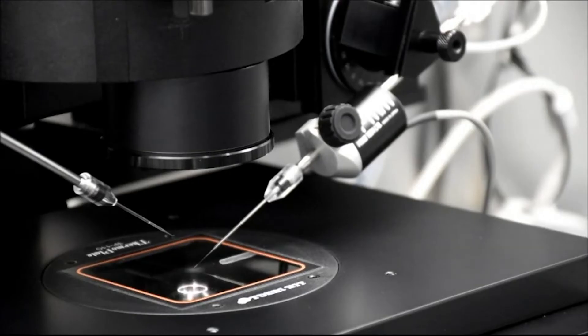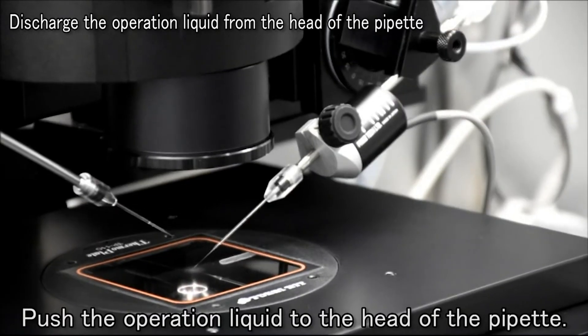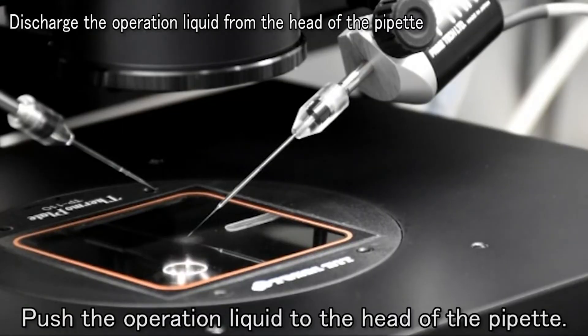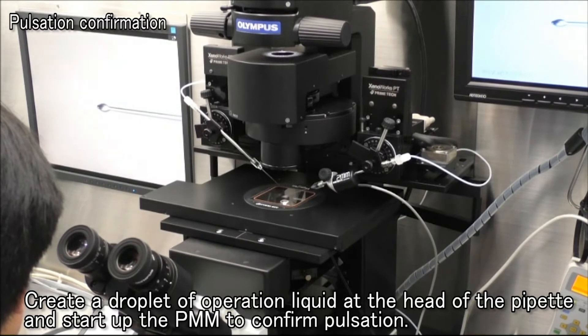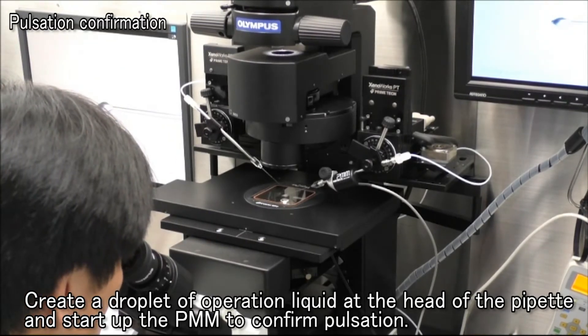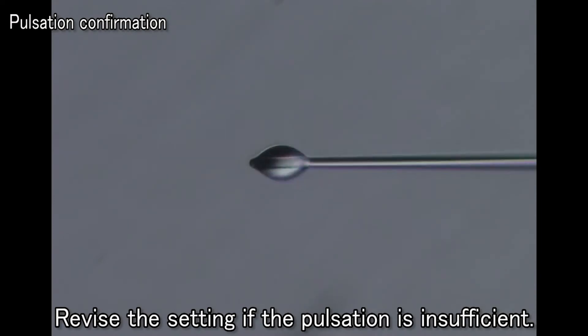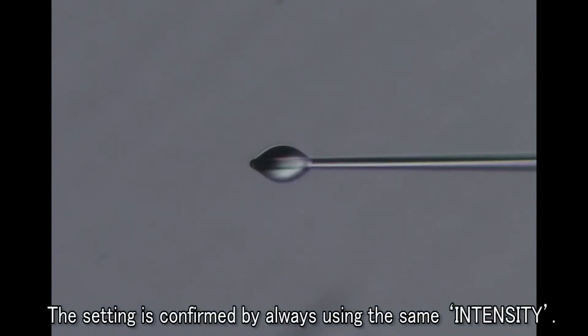We'll now explain how to confirm the settings. This pulsating sound is the operating sound of the PMM. Position the pipette in the microscope field. Operate the injector and push the operation liquid to the head of the pipette so that any air inside the head is pressed out. Confirm there's no air left inside the head of the pipette with your naked eye rather than from the microscope. After creating a droplet of operation liquid at the head of the pipette, start up the PMM. You can see the way the droplet bursts as the PMM starts driving. If there is no change with the droplet when the PMM is started up, it's necessary to revise the setting.